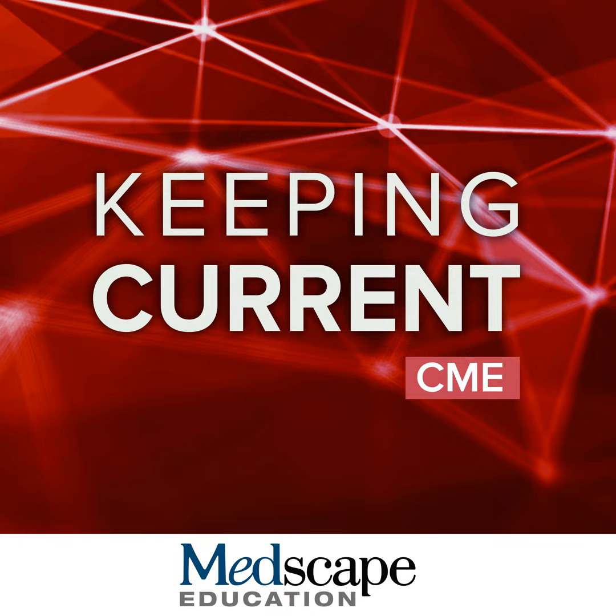If, on the other hand, their symptoms are more confusing, maybe they wax and wane, maybe they have a language focus, maybe you're thinking frontotemporal dementia, or in this case, this is an example of a patient who had a chronic limbic encephalitis. So you can see the hyperintense FLAIR signal in the mesial temporal lobes matched by hypometabolism on the FDG PET scan. So which PET scan you do next really depends upon that integration process of the symptoms.